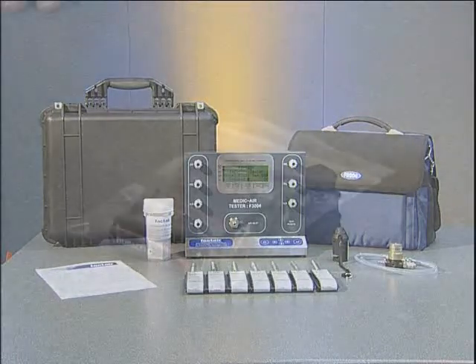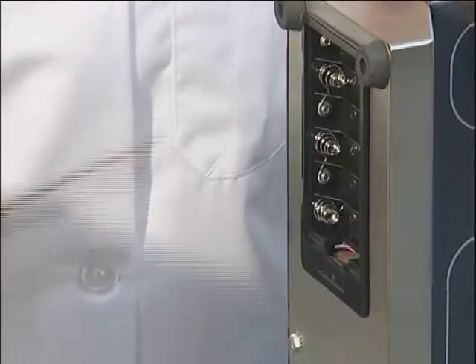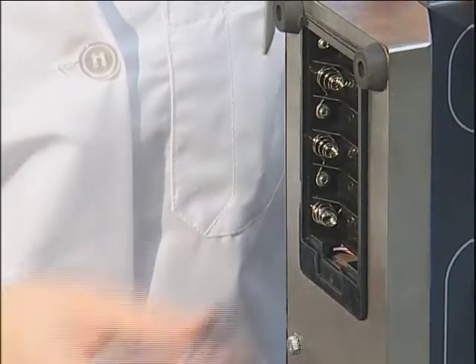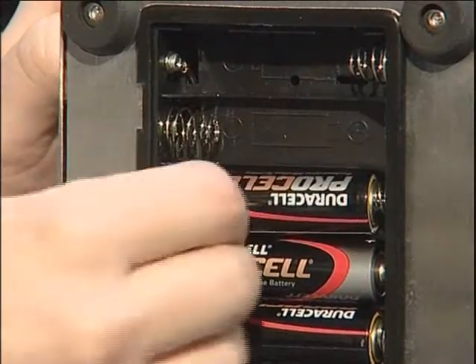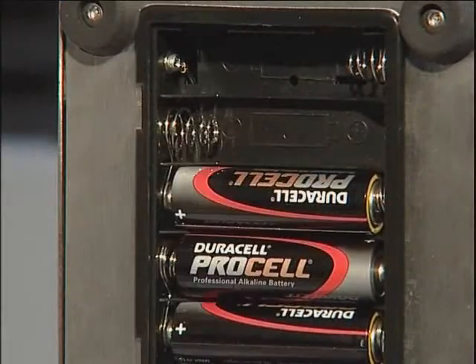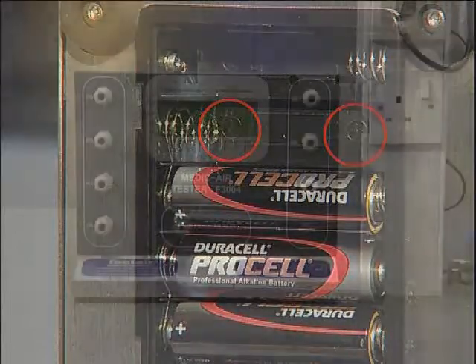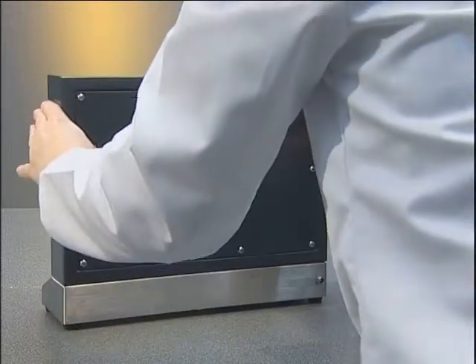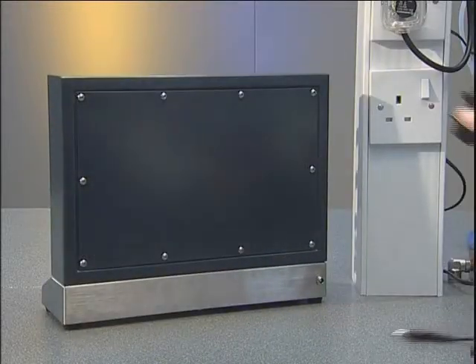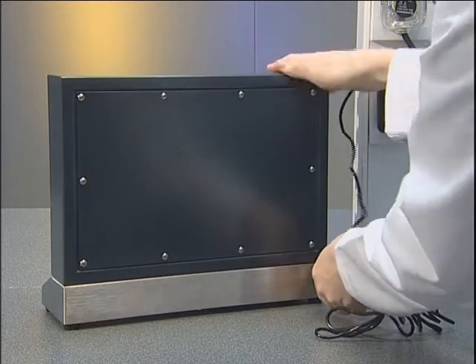The F3004 is supplied with batteries packed separately. Please note, rechargeable batteries are not suitable for use with this instrument. These must be installed prior to use, unless it's the intention to power the unit solely from a mains supply. It's important to strictly observe polarity when fitting batteries and ensure that they are correctly located. If the tester is to be used adjacent to a power socket, the mains adapter may be used. Please note that the unit should be switched off prior to connection or disconnection of the mains supply.